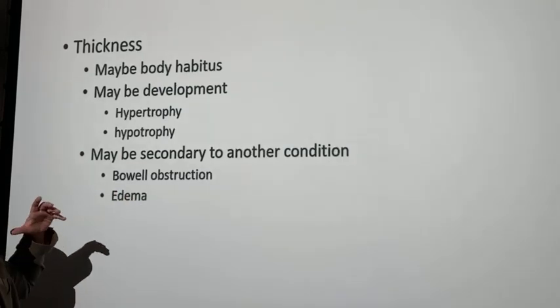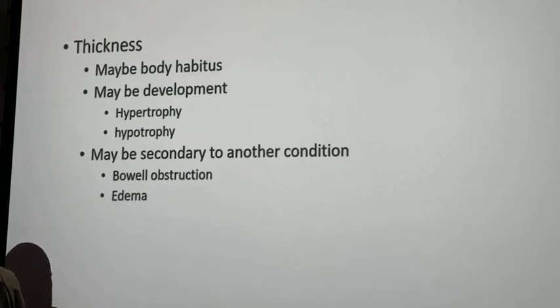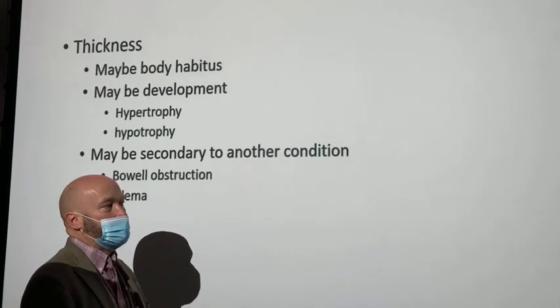Now, what's even better than taking a look at the patient? What should you be doing before you take an x-ray on every patient, especially portables? Look at the chart. Yeah, exactly. Look at the chart. Look at the chart. Why are we doing this?